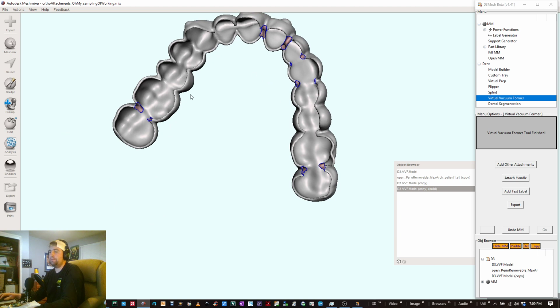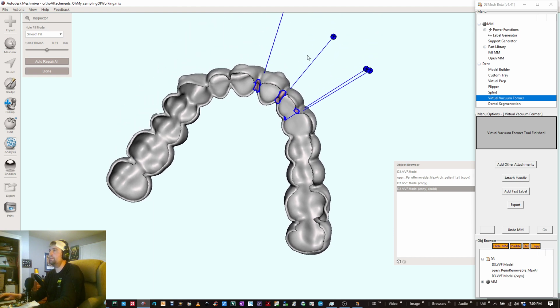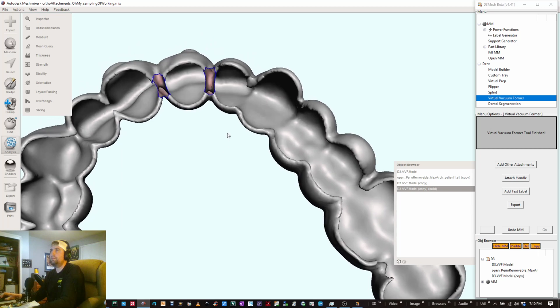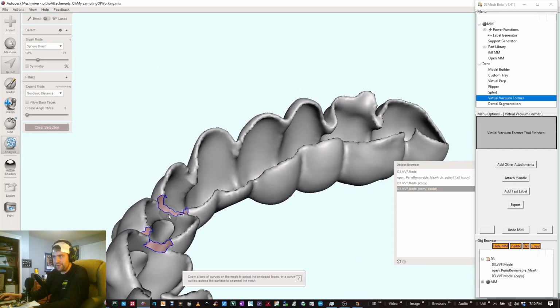And let's do these one at a time. The reason that one didn't go is because I didn't get down underneath it.